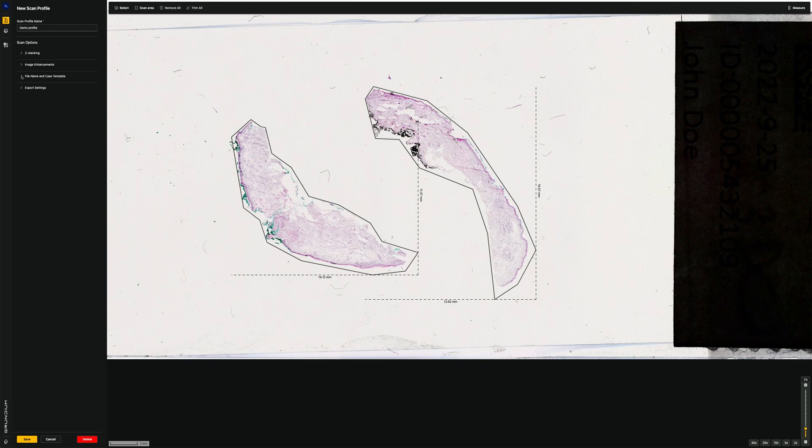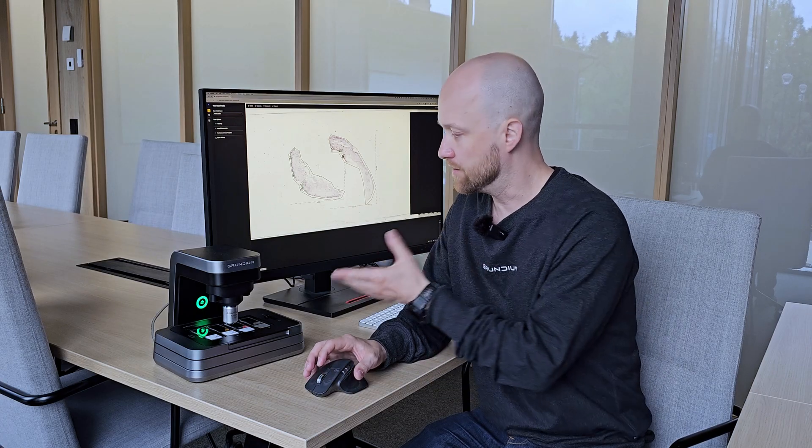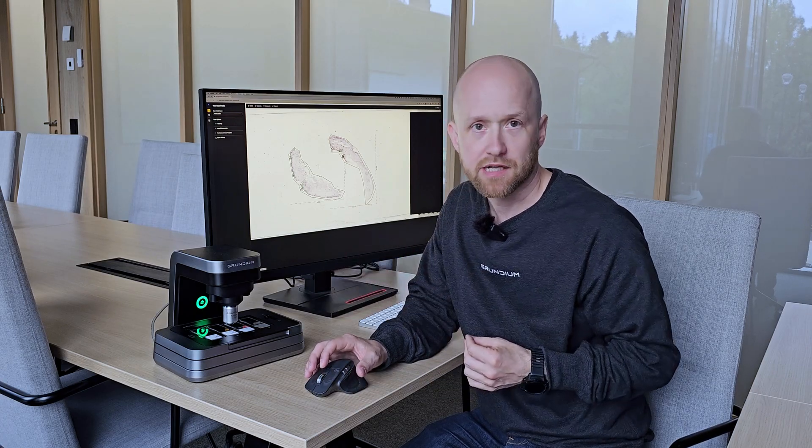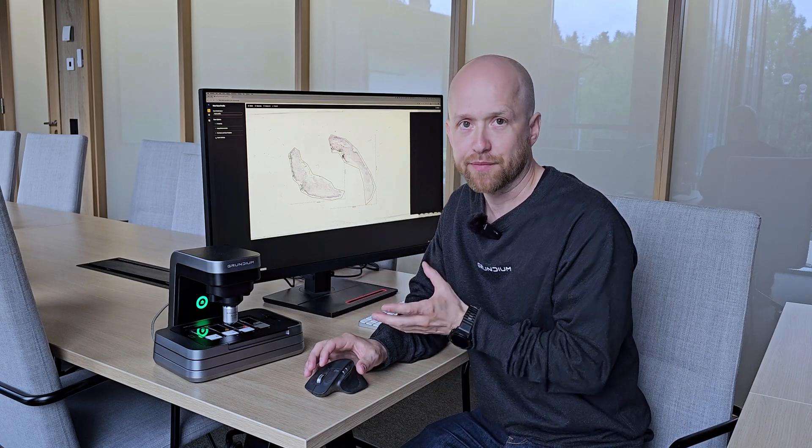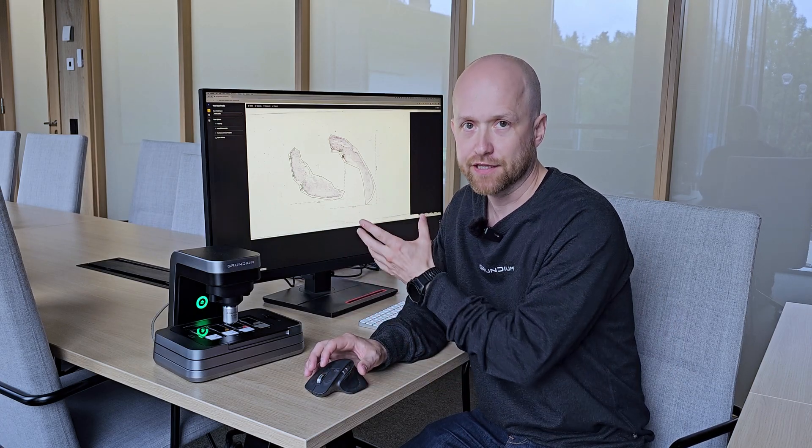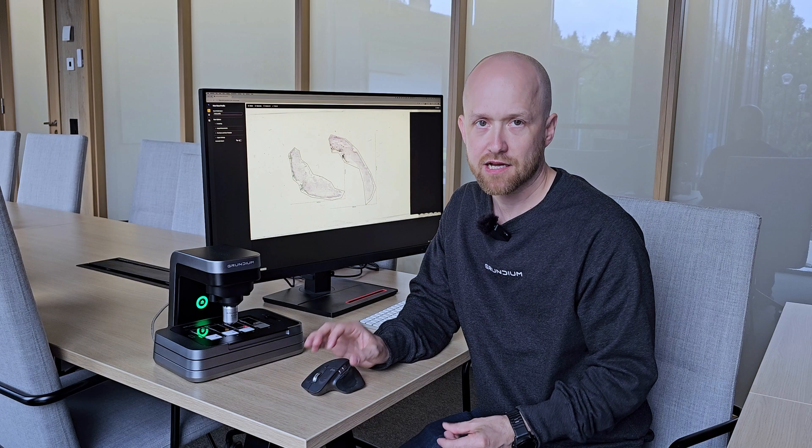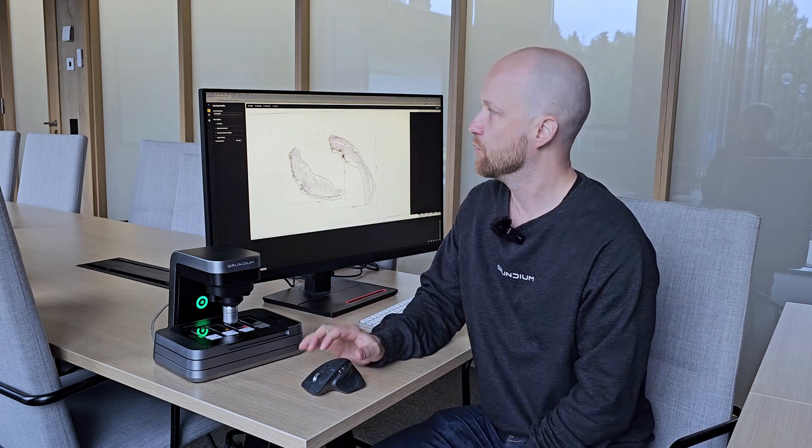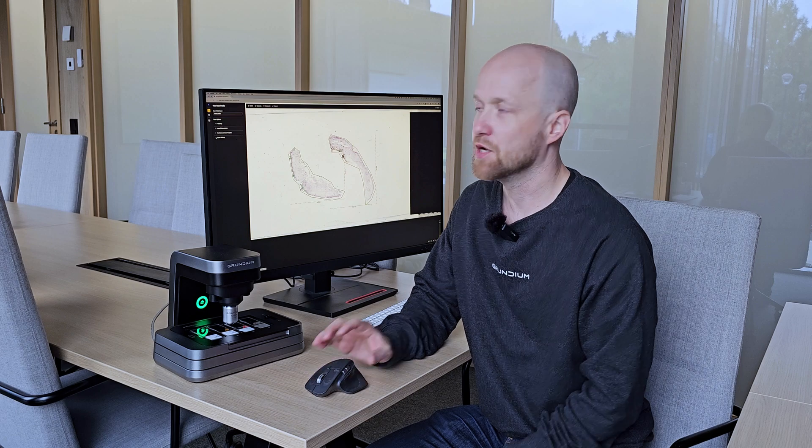And then we can have different file name, case name templates. For example, reading the slide label and using that information in the file name. And then we can also adjust export settings, export locations, and export file formats. So that's what can be defined within a scan profile.